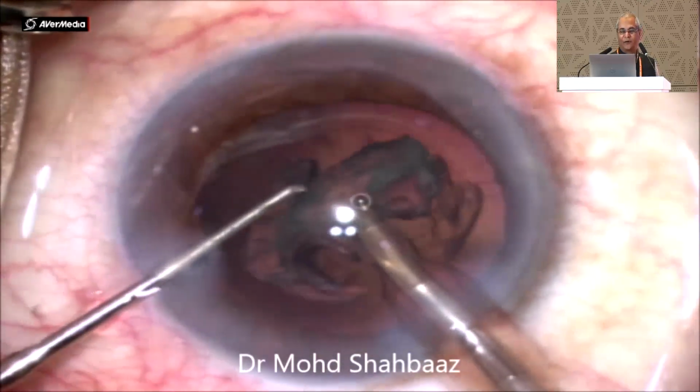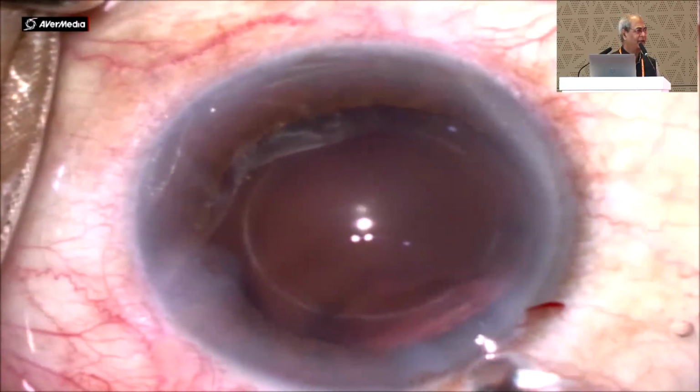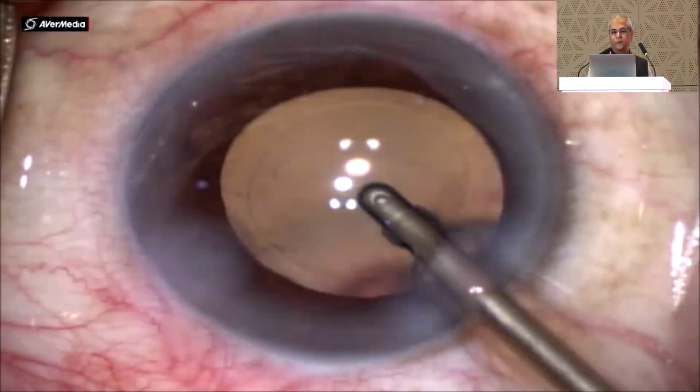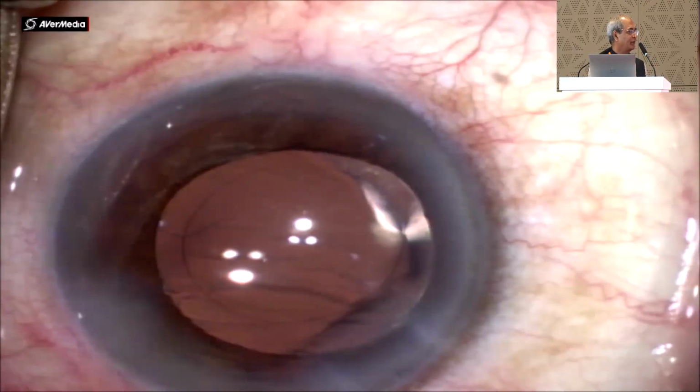So there is no cortical matter remaining, everything is done in one go. You can just implant the IOL. The rhexis size is again important. If you want it fully covered from all sides, it has to be 4.5 to 5.5.